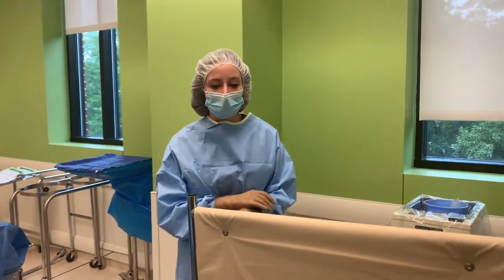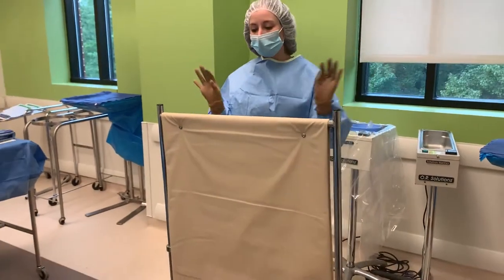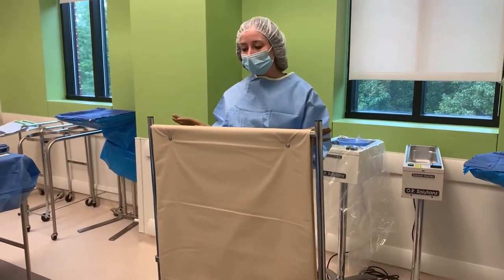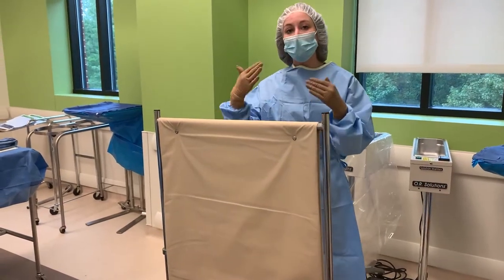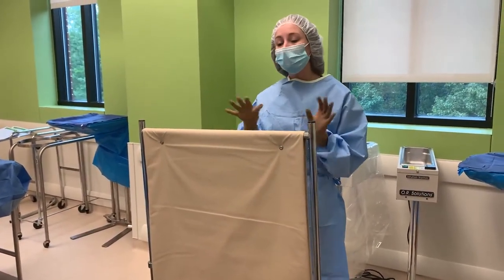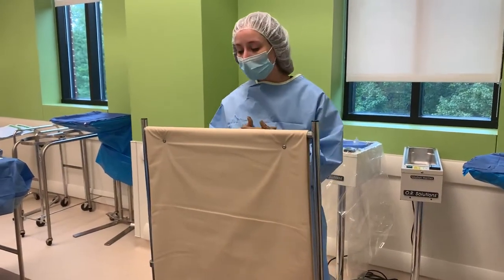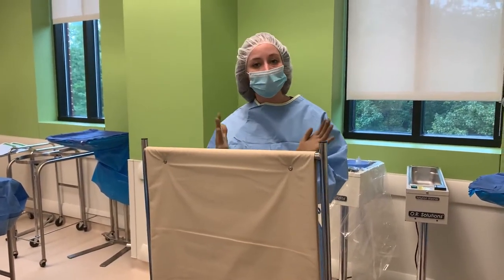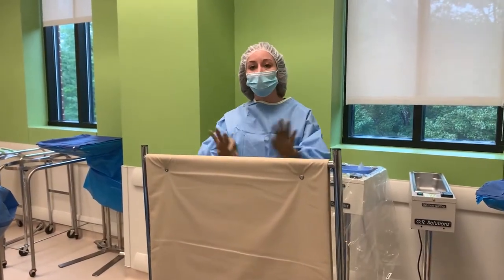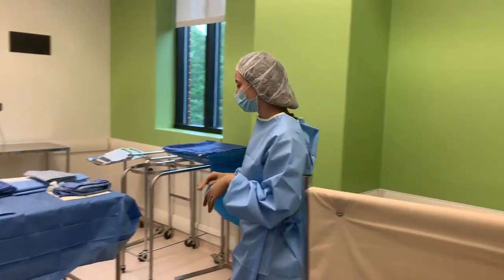We're going to go over how to drape a lead screen. You'll see this when you use fluoroscopy or the C-arm — this is something you hide behind and it protects you from the radiation. But this is unsterile, so we can't get very close to it, and sometimes the rooms don't have a lot of room. So we need to sterilely drape this so that we can approach a little closer.